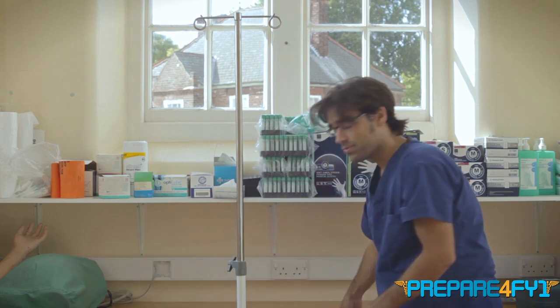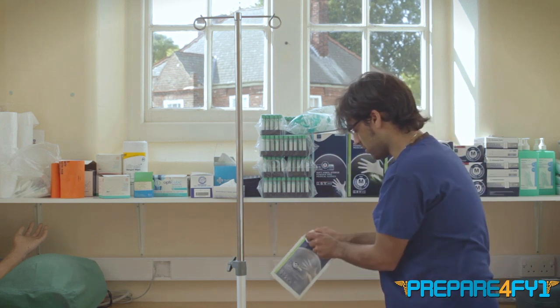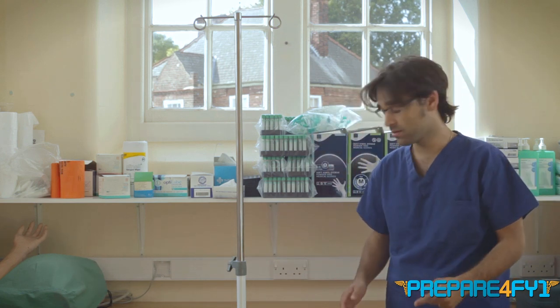When you open sterile gloves, you've got to bear in mind that it gives you a sort of mobile sterile field. You can open it — I'm putting it on the bench, but you would put that on your trolley that's already been cleaned — and you leave it like that.